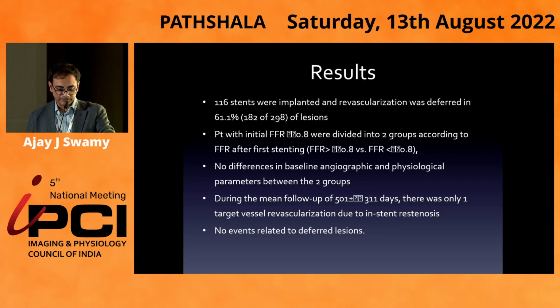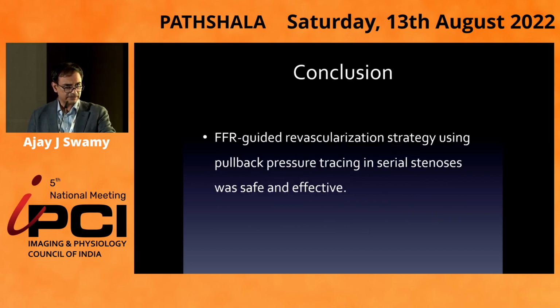During the mean follow-up, there was only one target vessel revascularization due to ISR and no events related to the deferred lesions. Thus, it was established that FFR-guided revascularization was actually safe and effective.